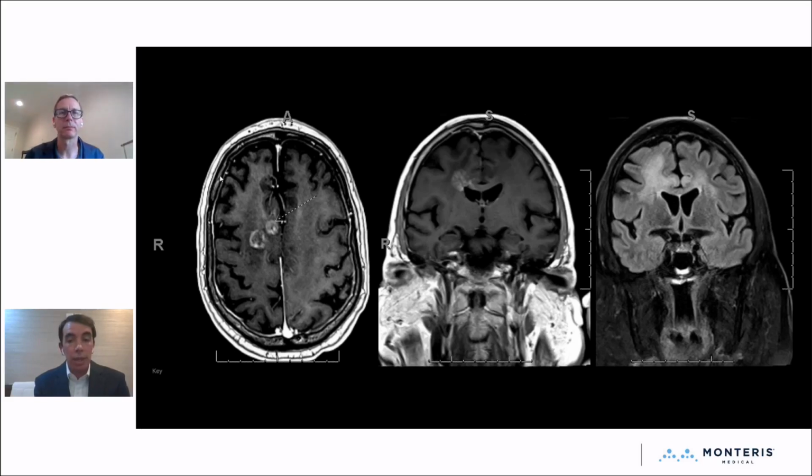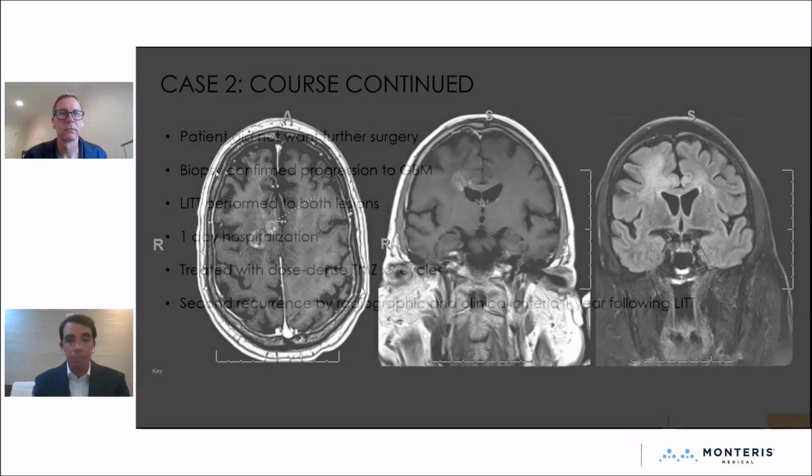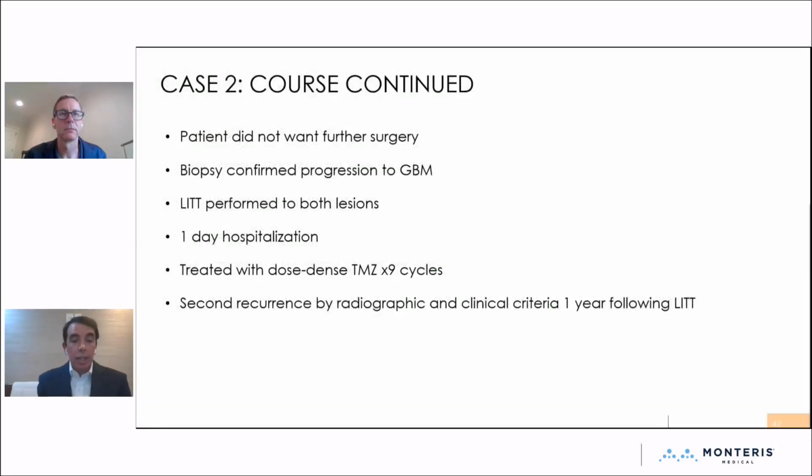And so the patient underwent stereotactic biopsy followed by LITT. And I think that speaks to our ability to both diagnose what's going on with these patients and then administer a therapy. And it also reminds us that 2 lesions can be treated successfully with LITT, and this was approximately the trajectory that was taken to treat both of these lesions in one treatment and in one pass or trajectory of the laser. The patient, at the time of discussing the need for surgery and LITT, didn't want surgery. And when we discussed the procedure involved in LITT and the 1-day hospitalization and these sorts of things, the patient was more amenable to that discussion.